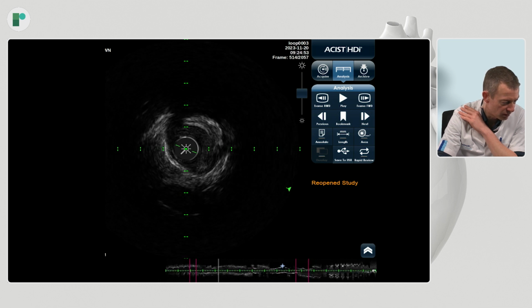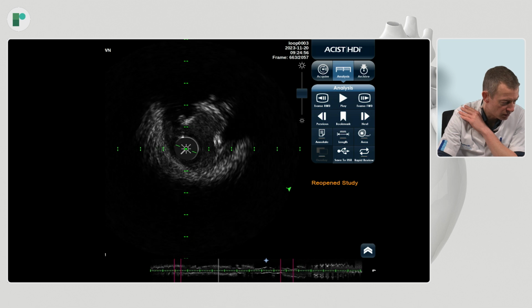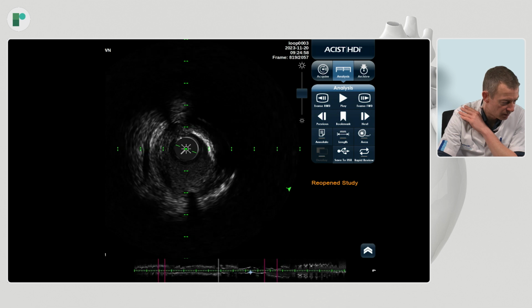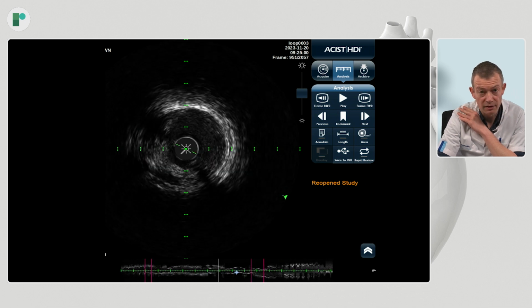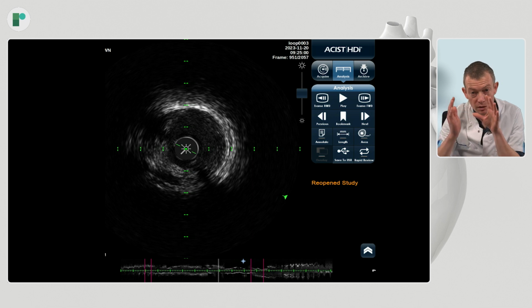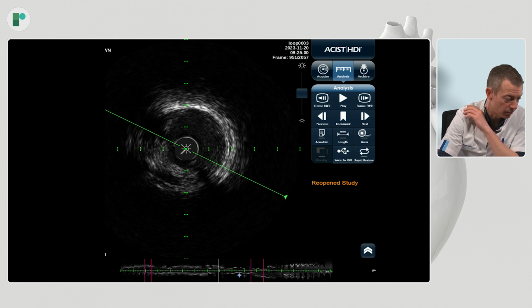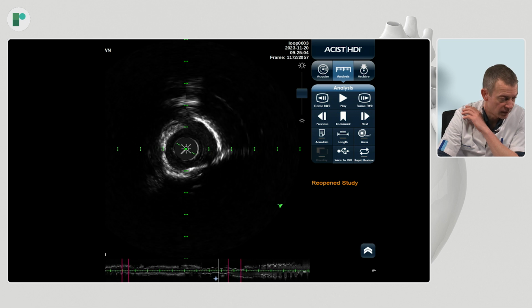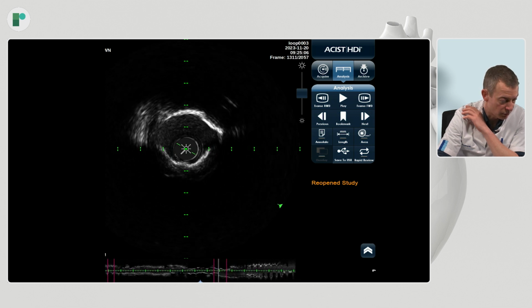A lot of plaque here, fibrocalcific plaque, big nodule of calcium here, which will obviously not disappear. Remember that. Whatever type of lesion or plaque modification you do, these thick nodules will not disappear. And at the end, they will make sure that your stent will be compromised a little bit, will have some eccentricity, so to say. And that's something you need to accept at some point. The only thing you don't want is a napkin ring of calcium that prevents the stent from being properly expanded.